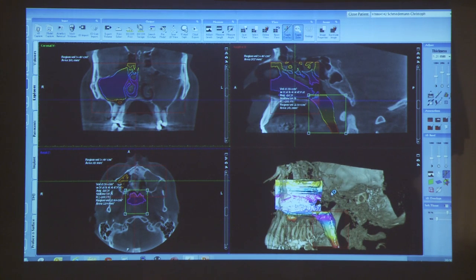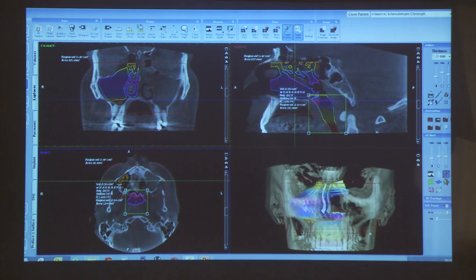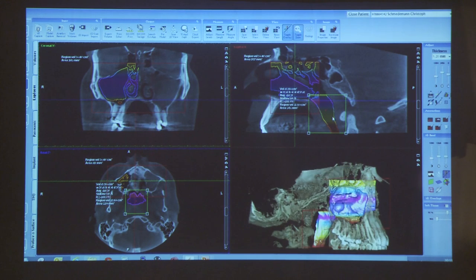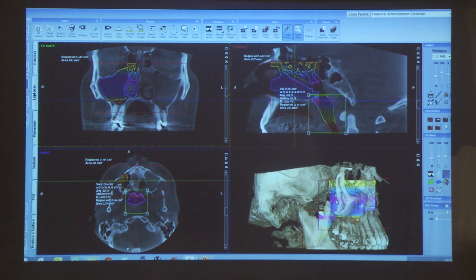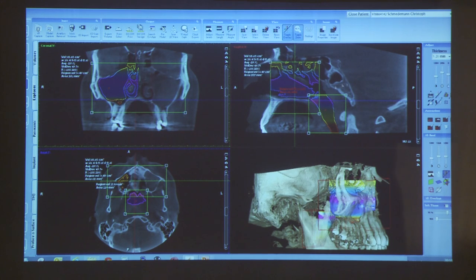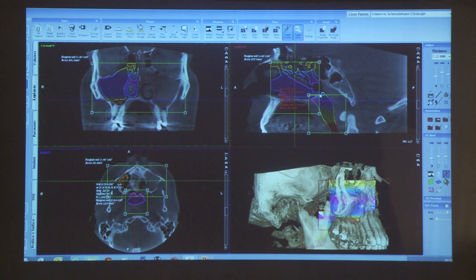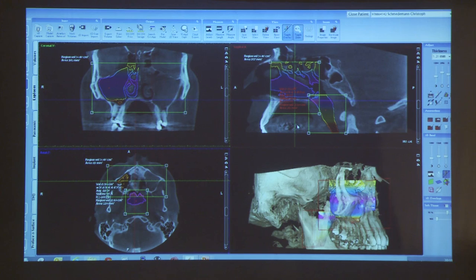This information you can easily extract from cone beam scans, and it's not taking so much time as you can easily see from Jonathan's demonstration. You need only a clinical question to do an image, and if the imaging is done for sleep apnea evaluation, the volume has to be determined, the image quality has to be determined, and the position of the soft tissues, of course.